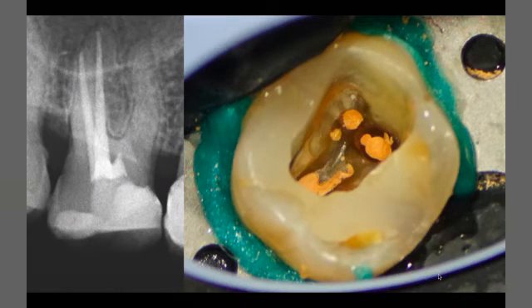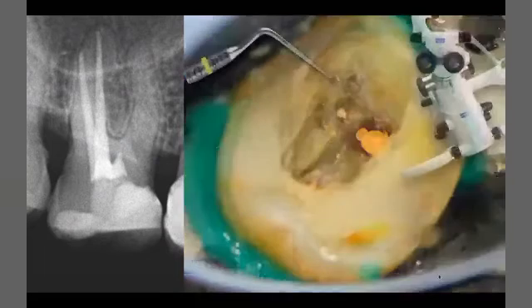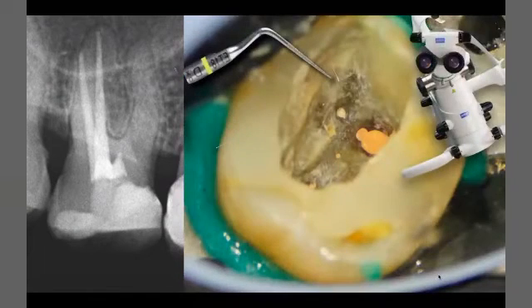And he told the patient we would reassess the tooth after maybe 3 to 6 months. After 3 months, the patient started to have pain on biting, and the tooth was sensitive to percussion. So he referred the case to me, and according to the X-ray, I have to open the root canal because I have symptoms now.